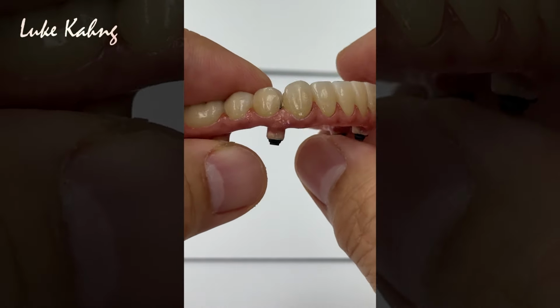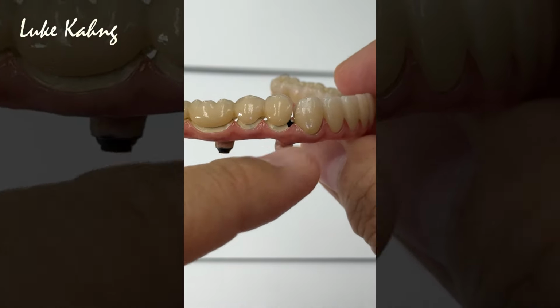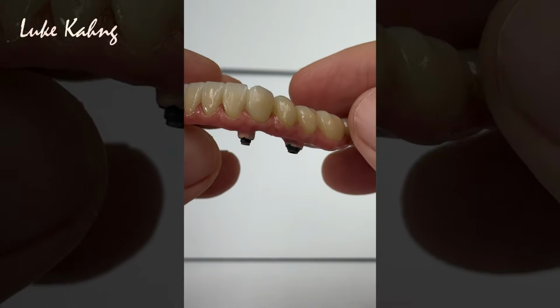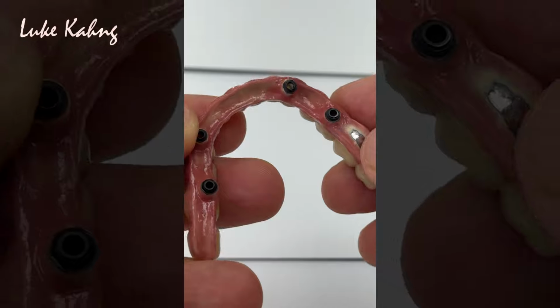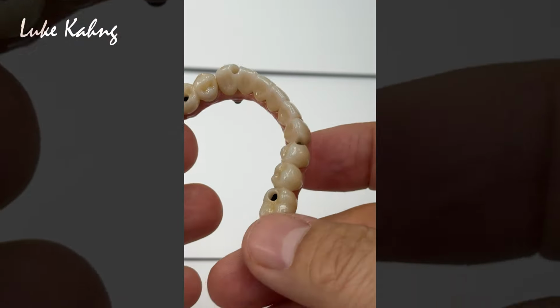And then cemented, it's great tensile. Then the doctor has to put some composite right after the screw down. This is the unbelievable thing, the restorations.